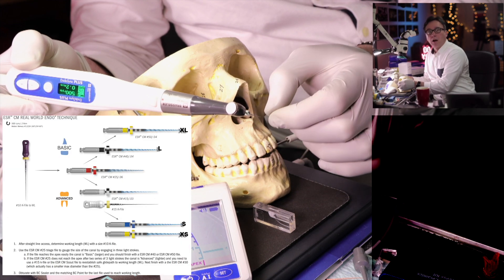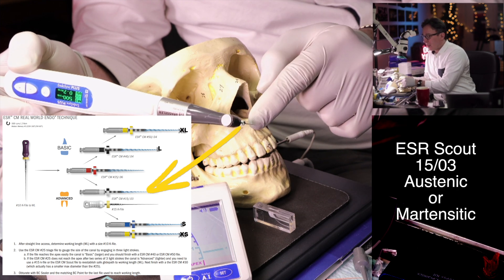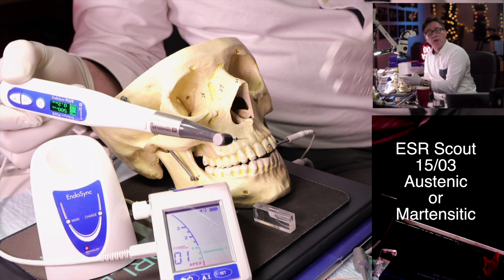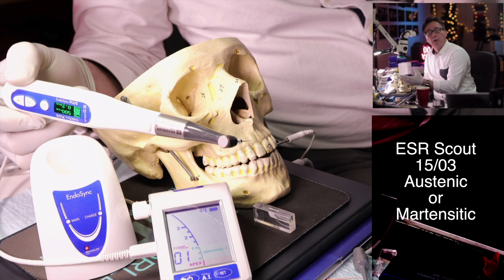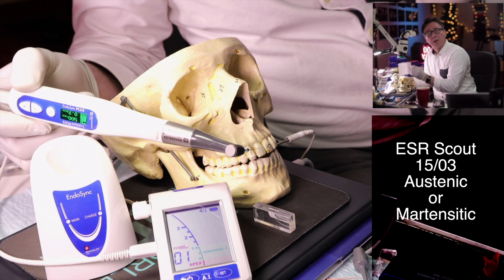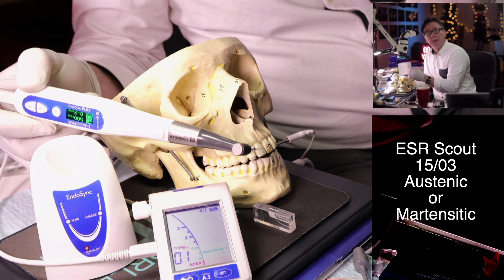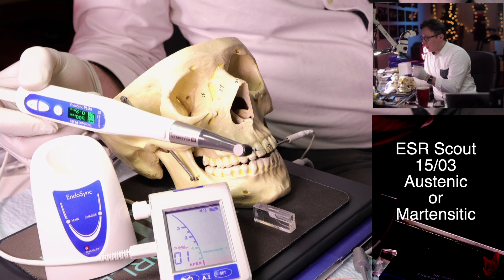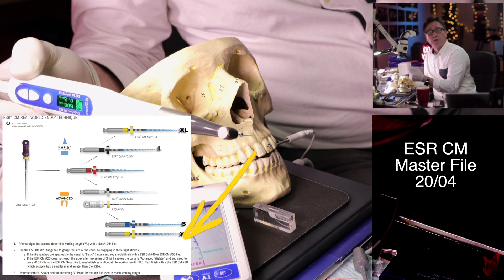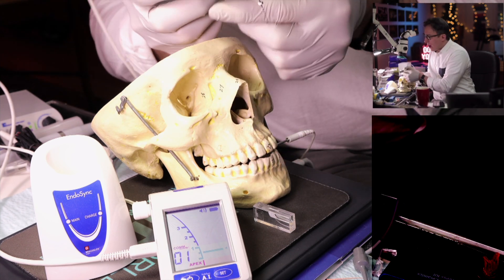I'm going to demonstrate the ESR Scout file, which has recently been updated. You have the 15/03 file in two flavors: austenitic and martensitic. Originally it came in martensitic, but that's way too flexible. I personally prefer an austenitic version for working length measurement — it has more strength and can navigate curvatures while digging through. There's also a new 20/04 finishing file added to the ESR CM line.